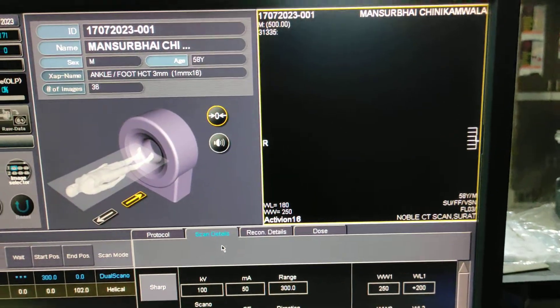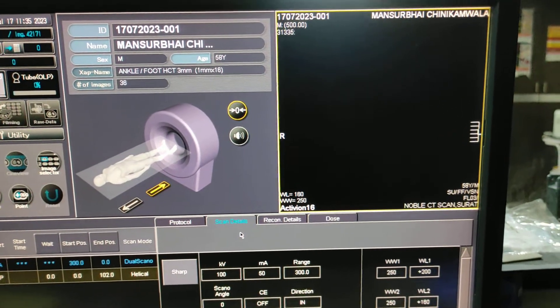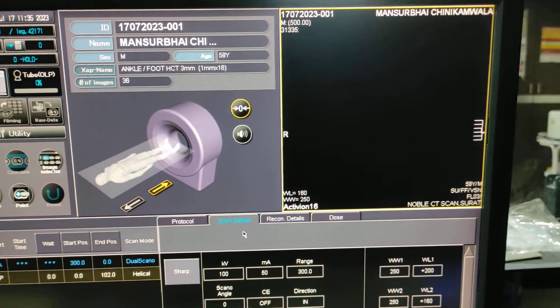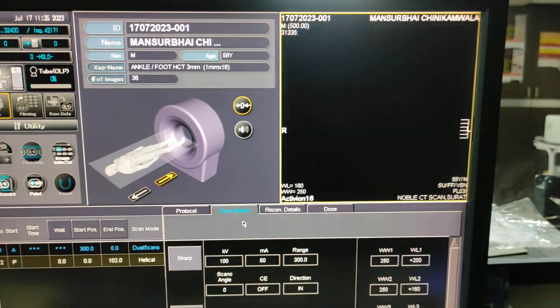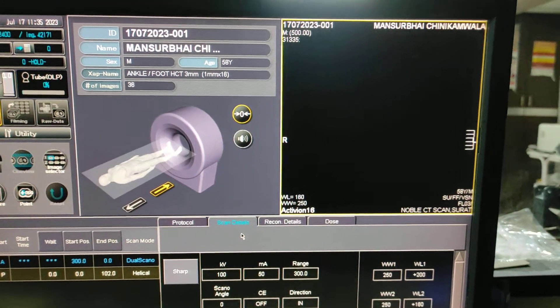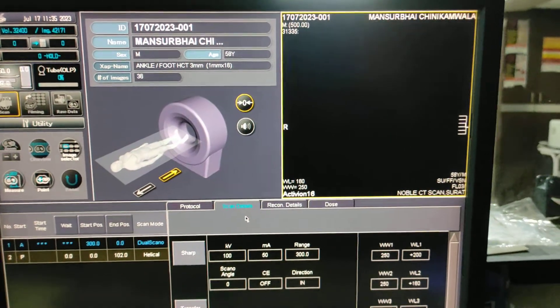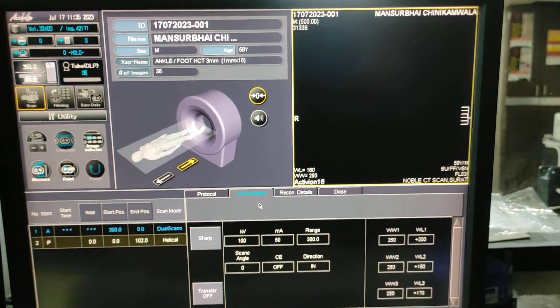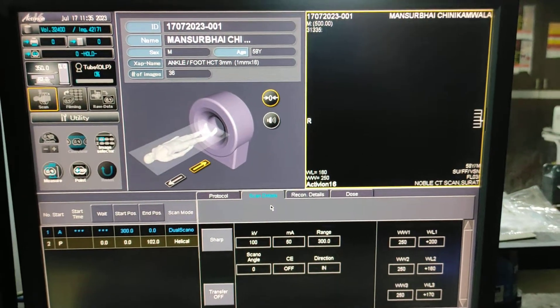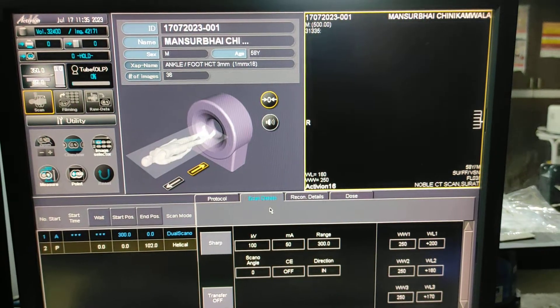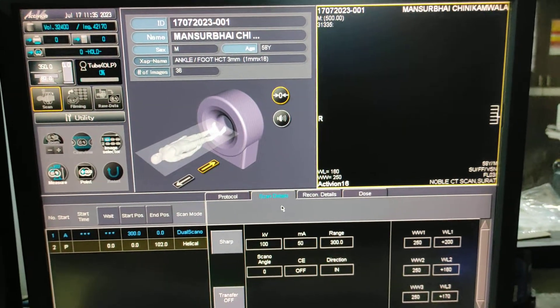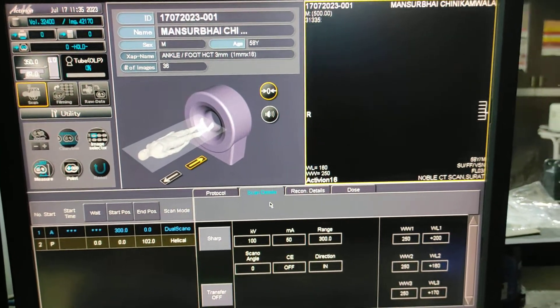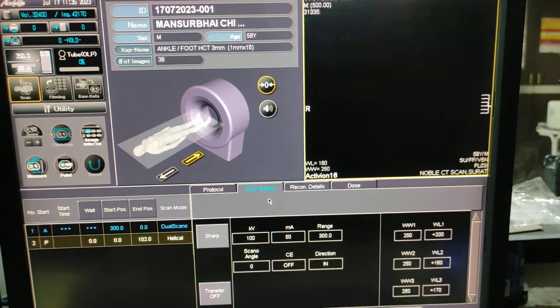You have to take two scout scans if you want, AP and lateral both, so that you should not miss the scanning area. The second scout scan will appear.